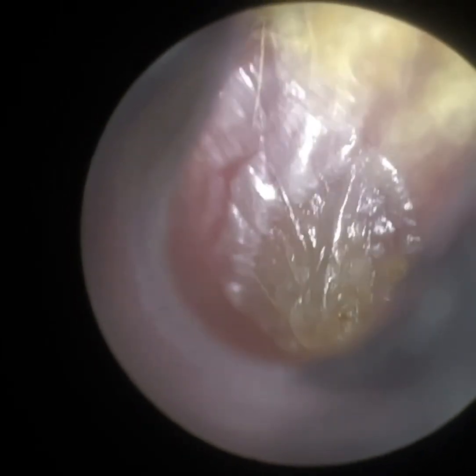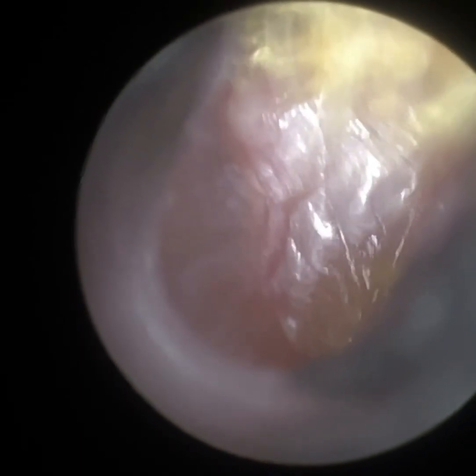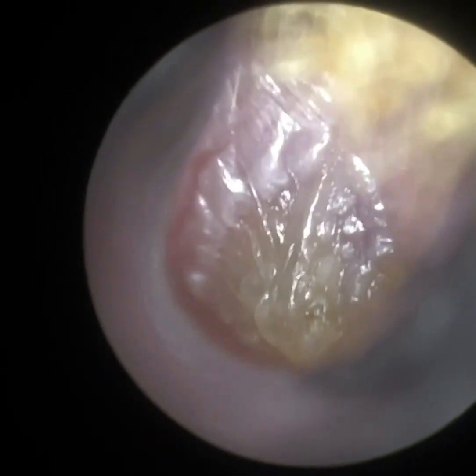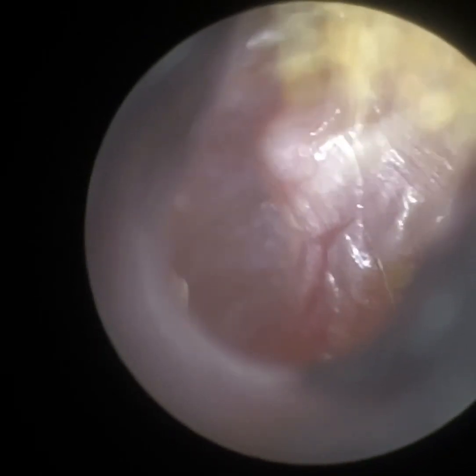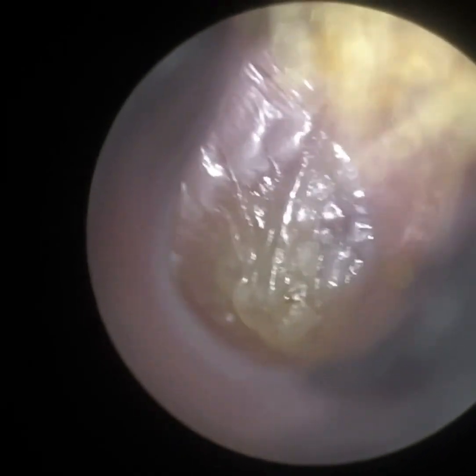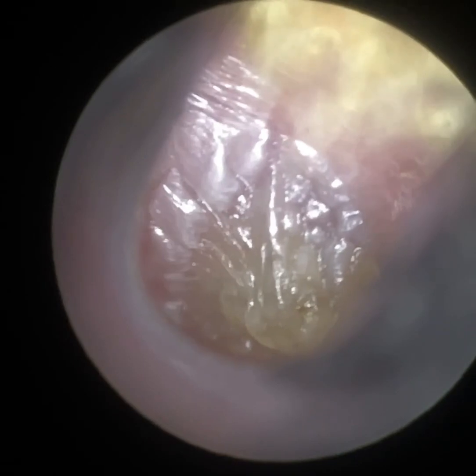Just going into the ear — that's the posterior part of the eardrum. There's some dead skin there, almost like a sack. I suspect that this eardrum was bulging a bit more. I did just hover over with the sucker, but it was actually part of the eardrum — almost like the eardrum was sagging. There's fluid behind there which caused the eardrum to bulge, and this bulging is now subsiding. There is confirmed glue ear. I did tympanometry — there's a flat B tympanogram with a normal ear canal volume, which is typical of glue ear.